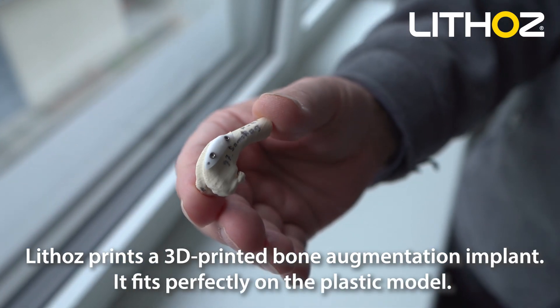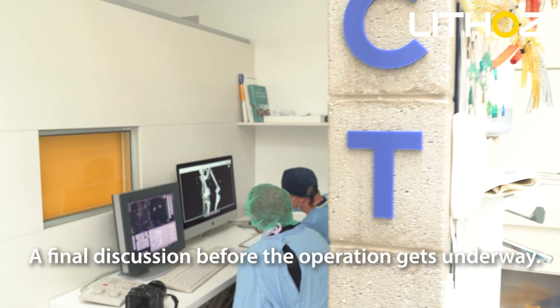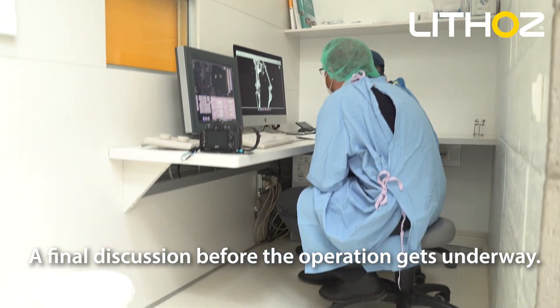It fits perfectly on the plastic model. A final discussion takes place before the operation gets underway.